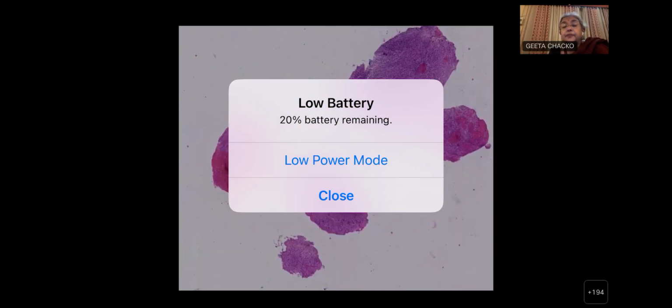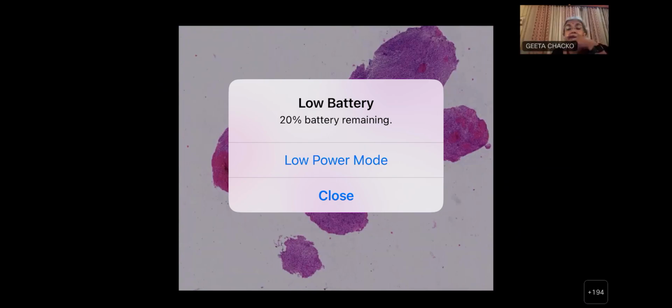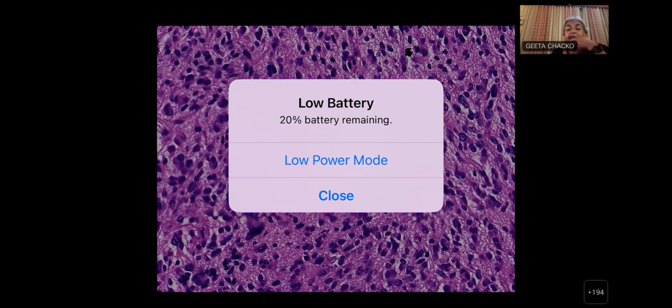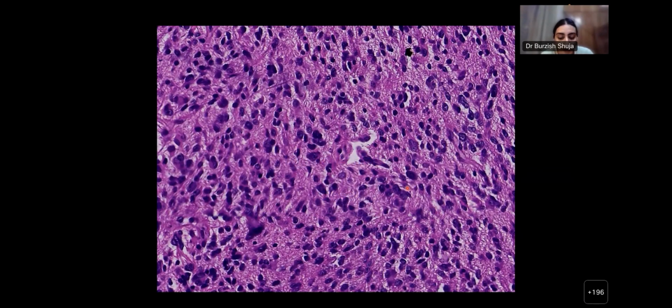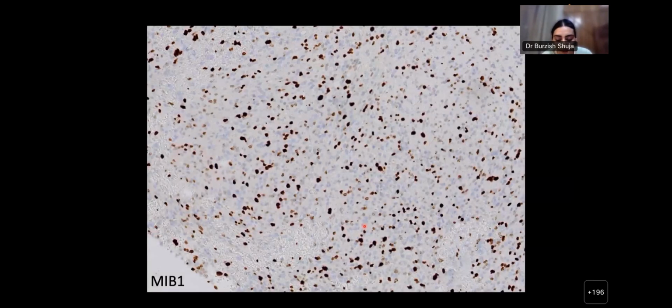In this histopathology section, we can see 5 tissue bits that appear cellular at this power, and a few of the bits show hemorrhage. Yes, diffuse hemorrhage. In this one, section 6 reveals hypercellular tumor. Tumor cells comprising pleomorphic cells having high NC ratio, hyperchromatic nuclei and eosinophilic cytoplasm. I think you're seeing too many prominent nucleoli. There's one here, but yes, you're right, it's hyperchromatic. Yes, and eosinophilic cytoplasmic processes blending with the surrounding dense fibrillary background, the matrix. Then there are a few mitotic figures, along with some vessels and hemorrhage.